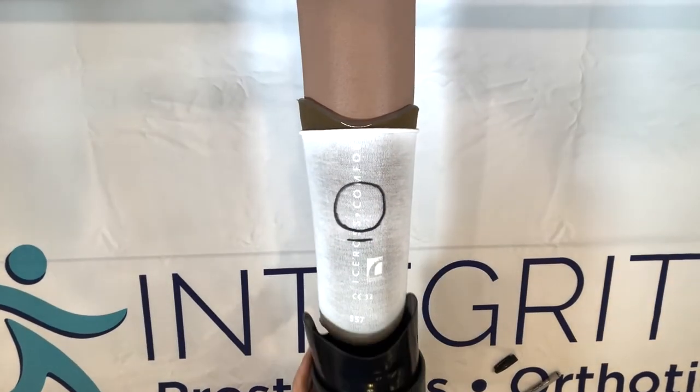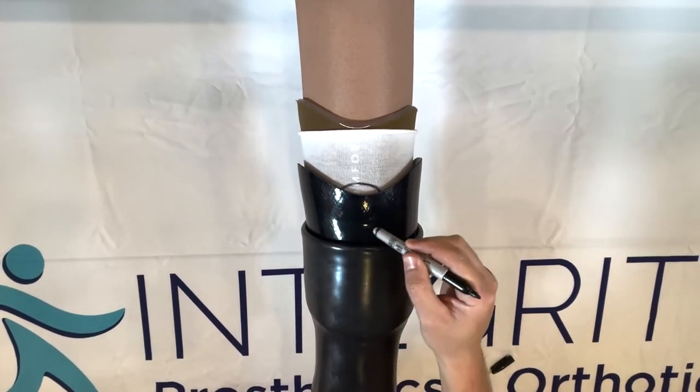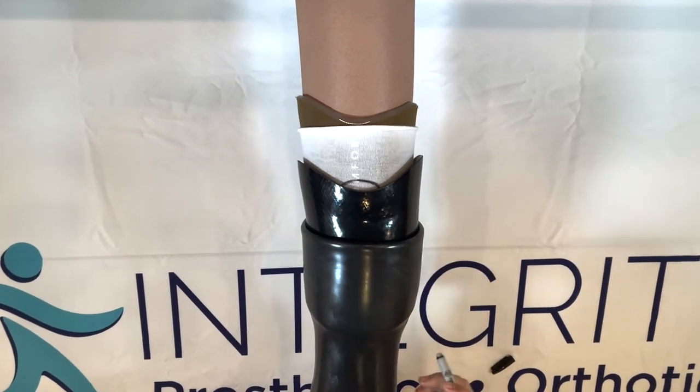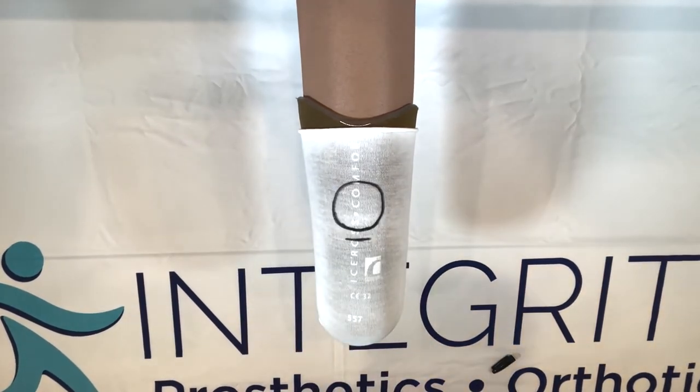To show what happens without enough socks, the kneecap is way down here, so you're going to have some impression down there on the kneecap which is probably uncomfortable. You'll notice that there's a lot of play in the socket — it's loose. So what we'll do is add some socks.